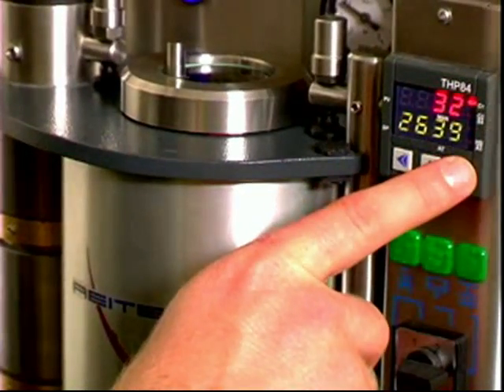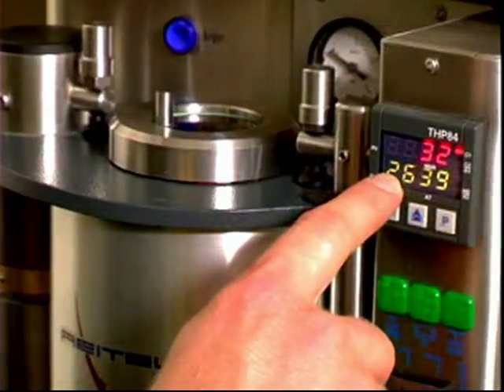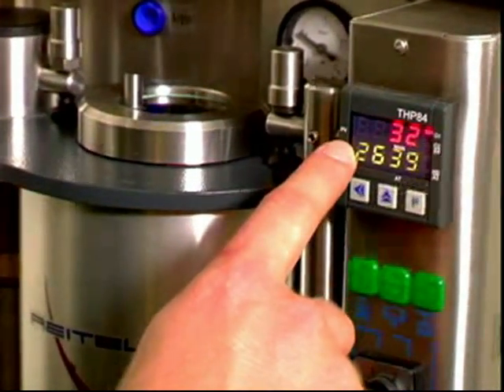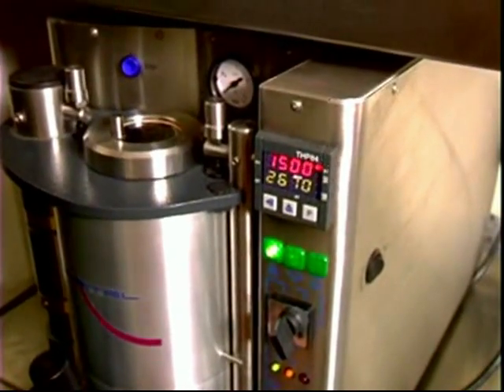This is the digital control unit. The bottom number is the temperature you will program into the unit. The top number is the actual temperature of the melting alloy. During the melting process, you will see the top number rising to the number on the bottom.